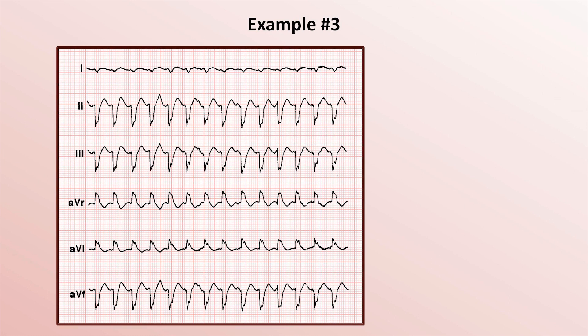The number of big boxes between each QRS complex falls somewhere between 1 and 2, giving a rate range somewhere between 150 and 300. If you remember that each large box is 200 ms, that means there are 5 large boxes in 1 second — so let's see how many QRS complexes occur in 1 second.